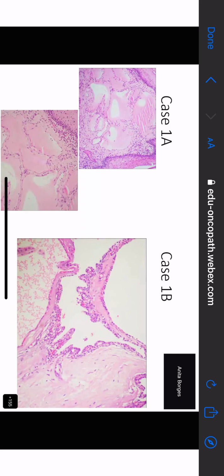Somebody said it's lymphatic spaces. Oh, somebody said it is lymphatic spaces, but that doesn't say, I assume that they think it is endothelium because it is lymphatic spaces, unless they think that lymphatic spaces are lined by something else. Any other answers in the chat box? Not yet, ma'am. Okay. So now, come on. We have to get to the bottom of this, Suveta.